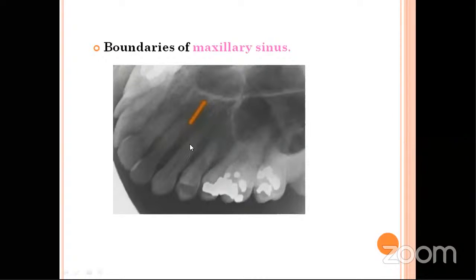So this is the lateral occlusal radiograph, which shows teeth and also some of the fillings. And this intersection of the two lines is called the Y line of Ennis. Some books give it as Ennis. So it is the Y line of Ennis, caused by the intersection of the floor of the maxillary sinus and the floor of the nasal fossa. Okay, so this is the lateral maxillary occlusal projection.